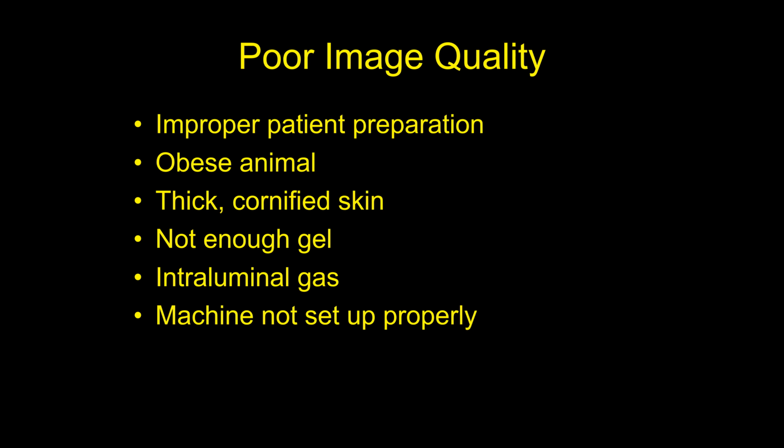The first one that I want to describe as an artifact isn't really an artifact. It's just you get a poor quality image. Okay. The liver looks ugly. The spleen looks ugly. Okay. There are several reasons that can cause a poor quality image on ultrasound. The most common one is going to be improper patient preparation.